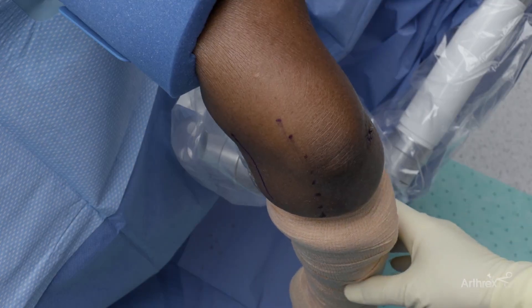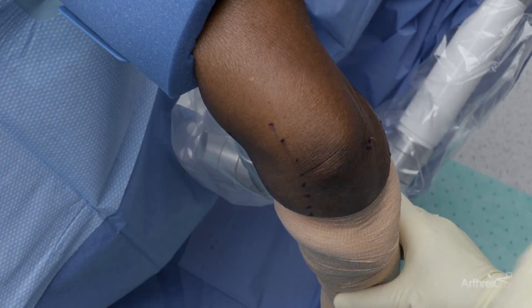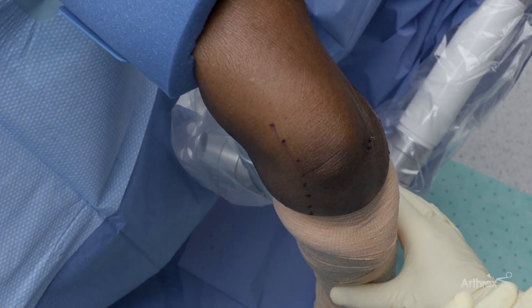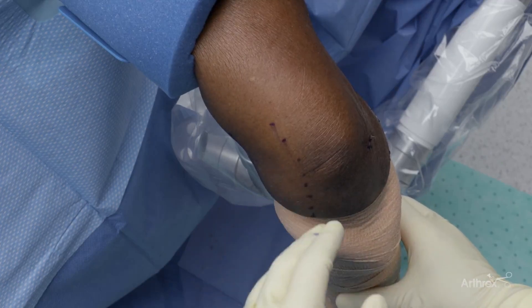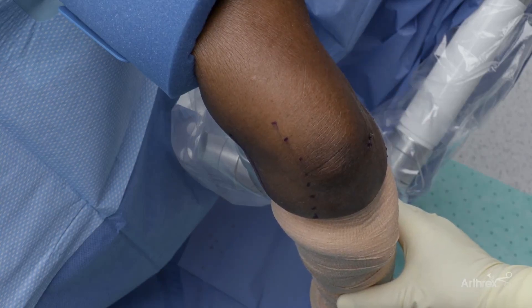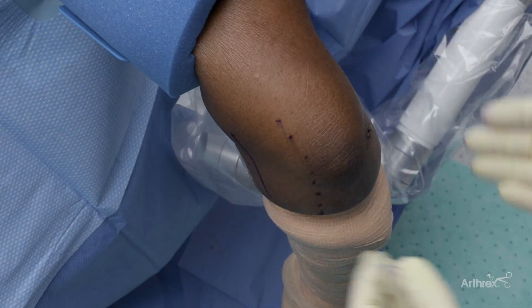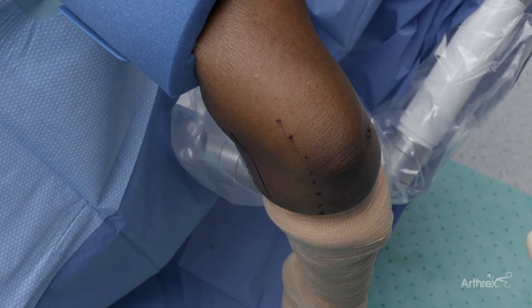This is a right elbow in the lateral position. One of the reasons I like the lateral position is that it serves several purposes. One is gravity helps distend the elbow. Two, it allows for flexion of the elbow to open up the spaces. And three, it allows us to work side to side without having to use multiple hands during the surgical procedure.